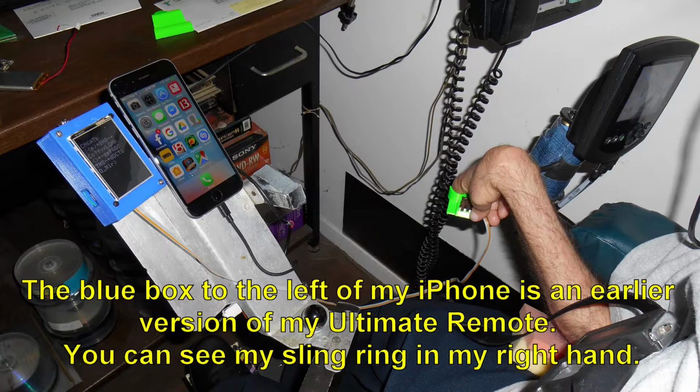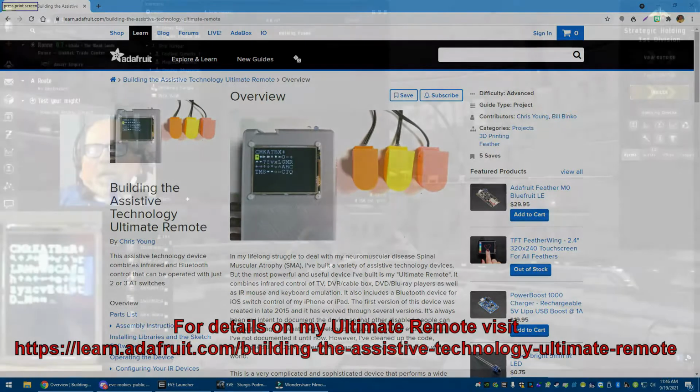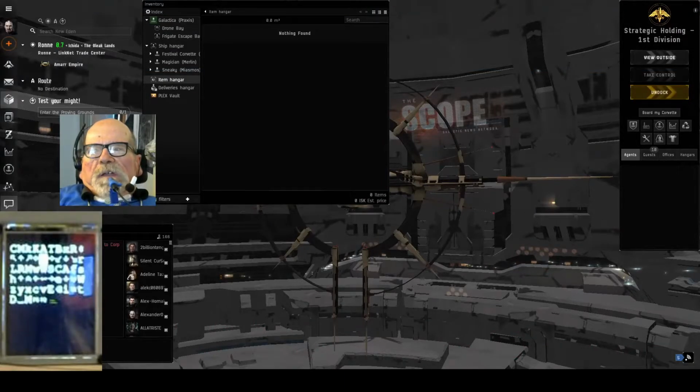It will Bluetooth connect to my iPhone. It will operate all the TVs and cable boxes in my house, and it will also allow me to move the mouse on my computer. Now I realize it's kind of fuzzy and out of focus, but this was the best I could do with a webcam pointed at this little LED display, or LCD display with a backlight.